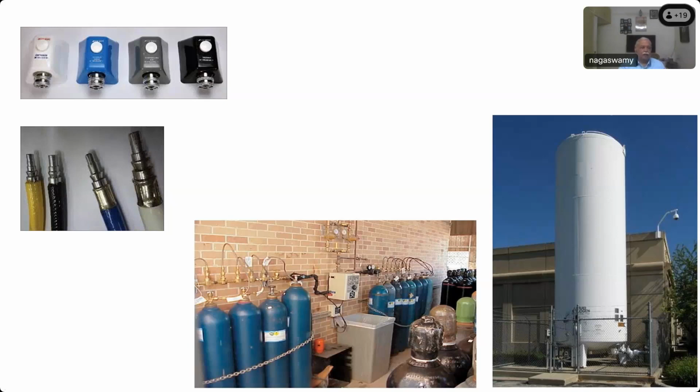So they are called non-interchangeable varying diameter probes for insertion into what is this portion called? When you don't use this, will any gas come out through this? No, sir. So how is it prevented? There is a disc. When you push this probe inside, the disc is shifted away and the probe goes in and has a hole here to receive the gas. This is called the Schrader valve.